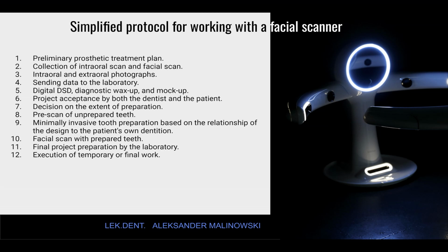Then we should decide about the extent of the preparation. We should always remember about the pre-scan before preparation. Then we should make minimally invasive tooth preparation based on the relationship of the design and the patient's own dentition. Then we should make one more scan with the prepared tooth.